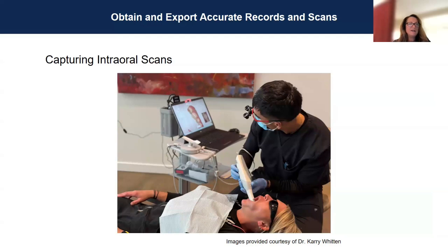Anybody have any issues with sometimes capturing further back? We do have a question in regards to this. They mentioned several companies, Invisalign, SureSmile, and a few others, allow you to use screenshot JPEGs of the scan in place of intraoral photos. Does that work with NDX as well?